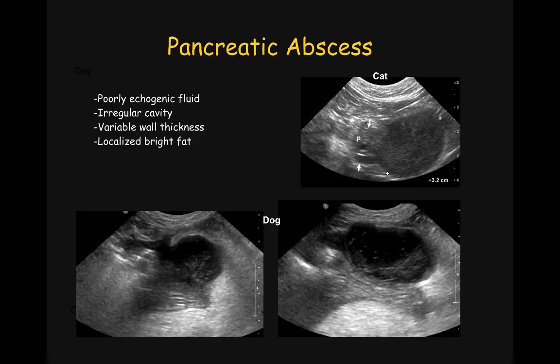Pancreatic abscess may appear as poorly echogenic fluid collection without or with variable thickness of a wall, often surrounded by hyperechoic fat. This collection of fluid may be adjacent to the pancreas or within the pancreas as we see in this cat. Fine needle aspiration to drain part of this fluid is necessary to make the difference between a pseudocyst and an abscess. This distinction is important as pancreatic abscess will require surgical intervention.